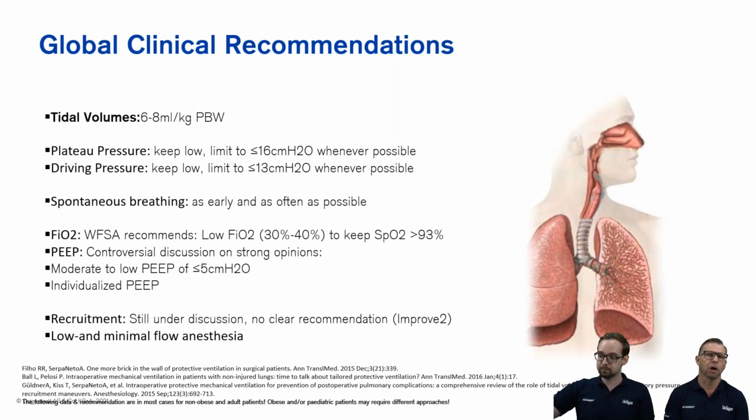And of course, low and minimal flow anesthesia has a great lung protective ventilation effect by keeping the airways nice and moist, and also great for the environment, as we know.